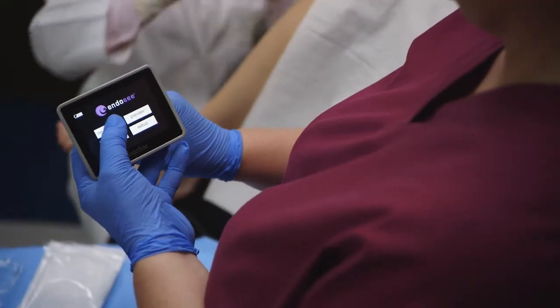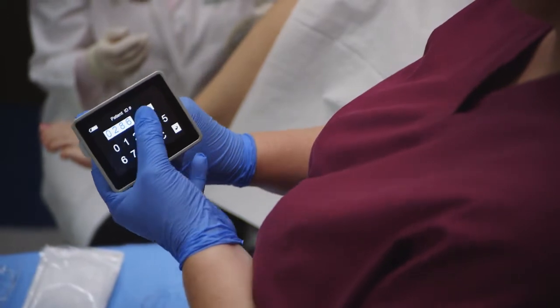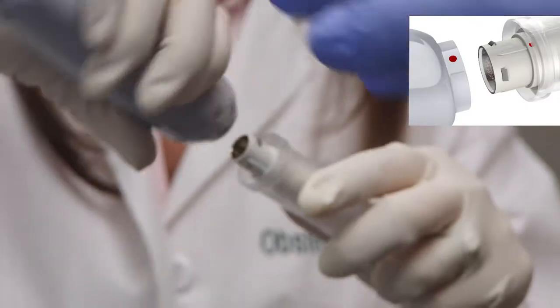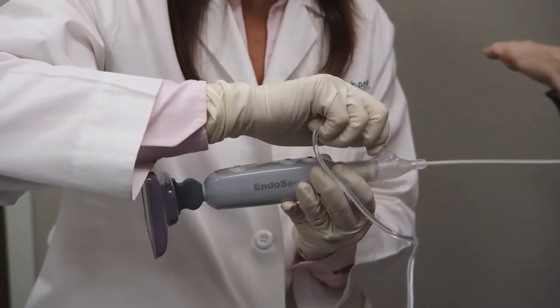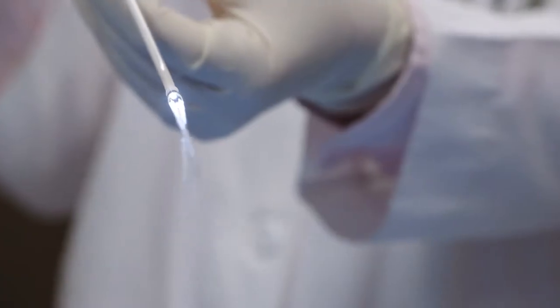To begin, turn on the EndoSea handset and enter the patient ID number. Align the red dots to connect the handset to the cannula, then connect the tubing to infuse saline and purge the system of air.